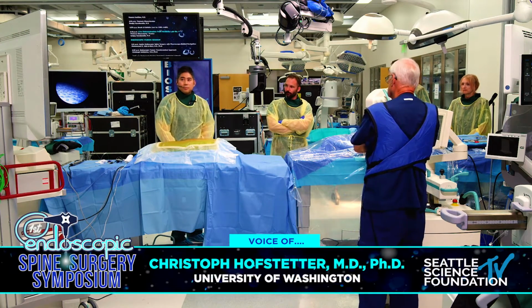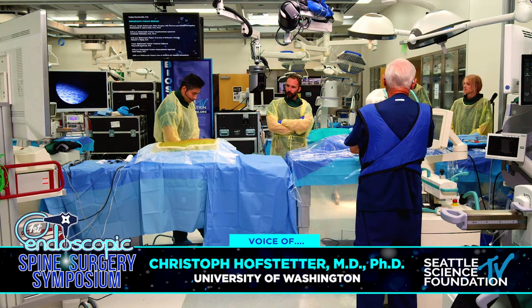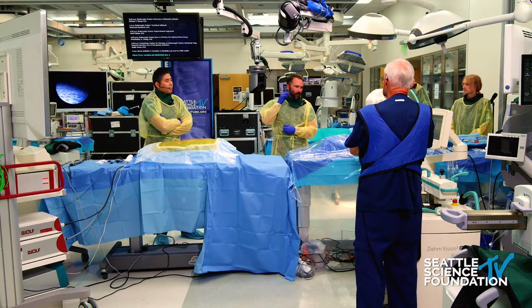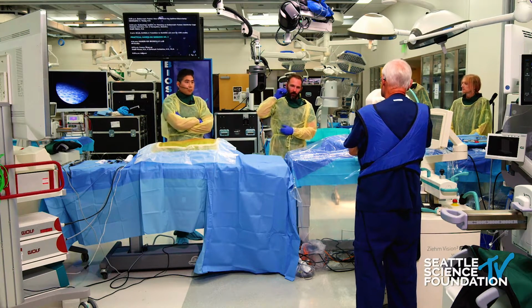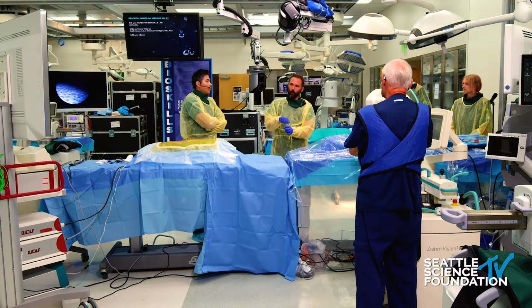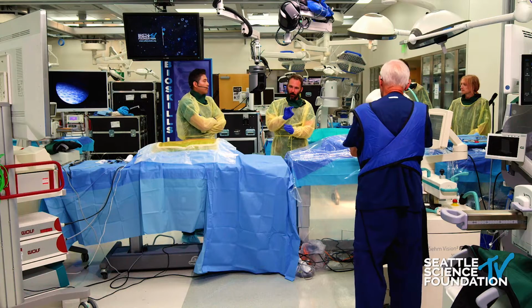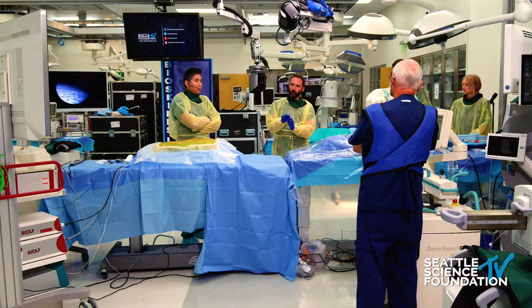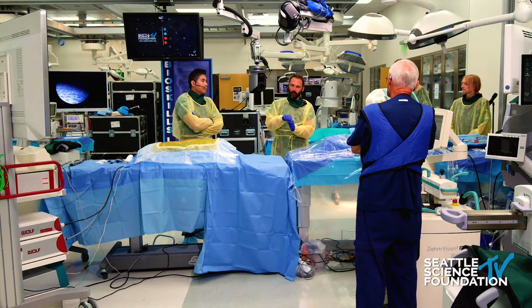Helen, for our audience that might not have as much experience with navigation, where do you think the biggest value is in what procedures that you see with navigation? For sure, I think the cervical spine. One thing that gives surgeons pause about doing a cervical endoscopy is dilating over the cord, and having to put downward pressure to dilate over the cord. So what I like to do is total navigation. I take a spin right at the beginning of the case. I use the navigation to plan my entry point, and then I use my pointer as I'm dilating down to make sure that I'm not too deep. I am exactly where I think I am.